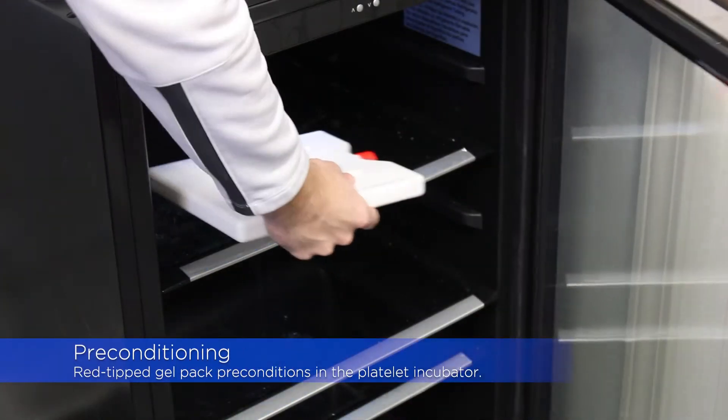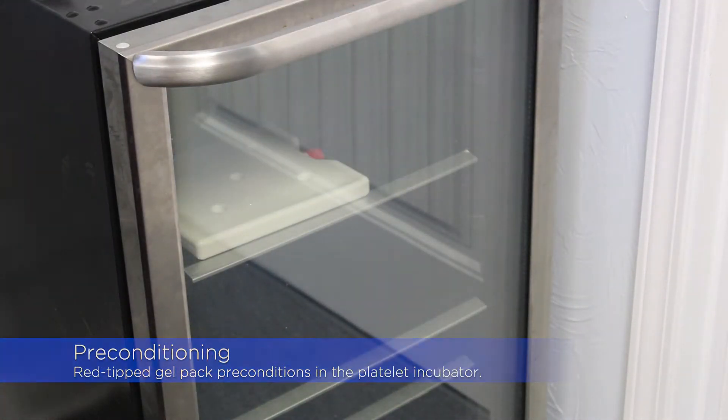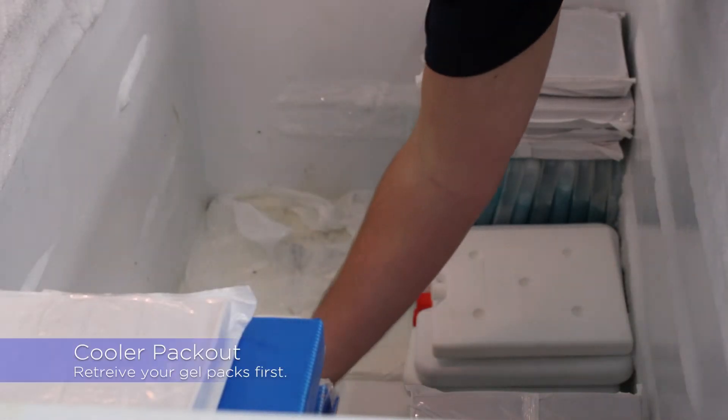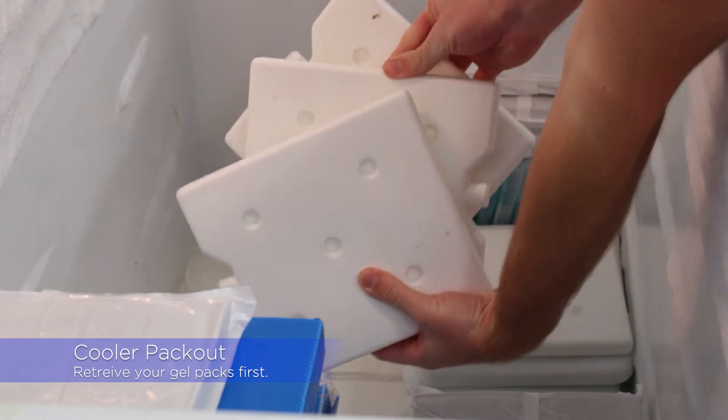You will need to pre-condition the white SG22 gel pack in the platelet incubator. Once the gel packs are pre-conditioned, you can go ahead and get them ready to place inside your MTP 2.0.